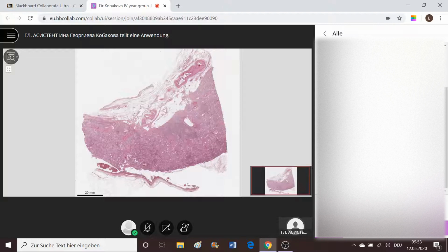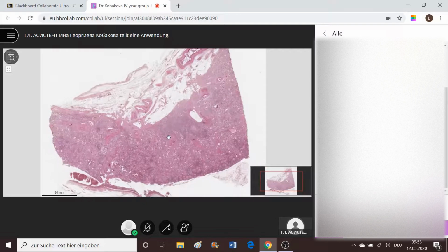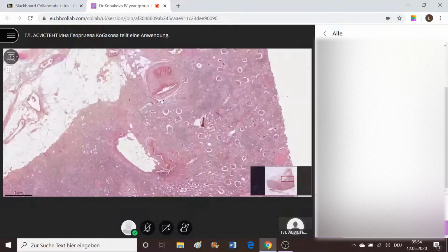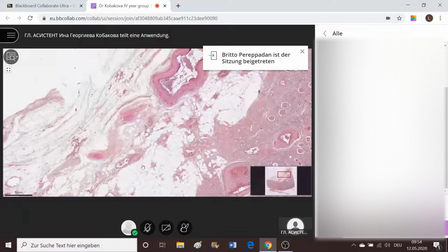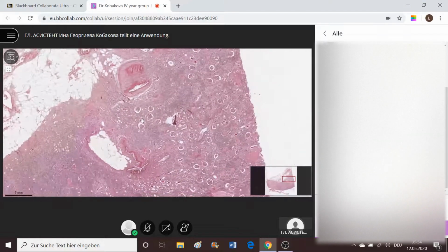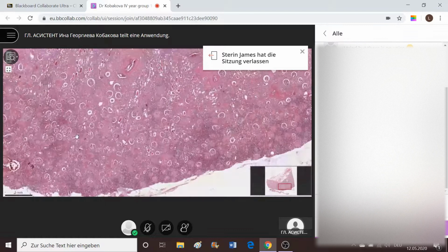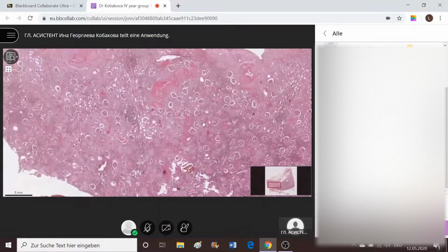I think you need a little bit larger magnification of the slide to see how it's generally looking. So what you're seeing here is the pelvic fat tissue, vascular system here observed well, inflammatory infiltrate diffusely in the parenchyma of the kidney, which goes in between the glomeruli pretty much everywhere.